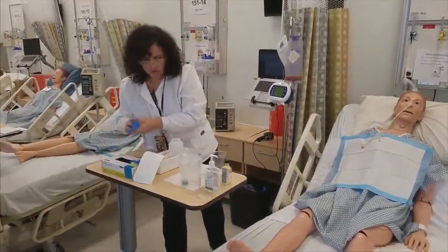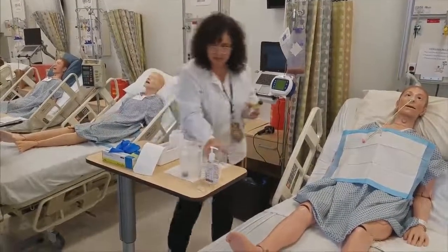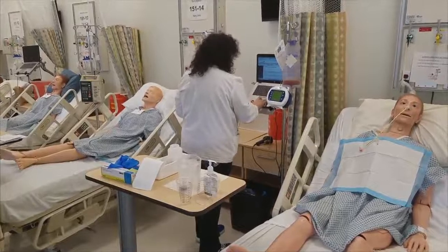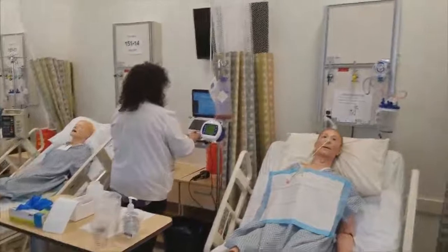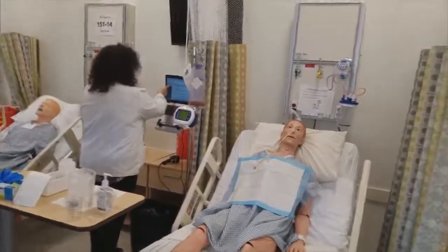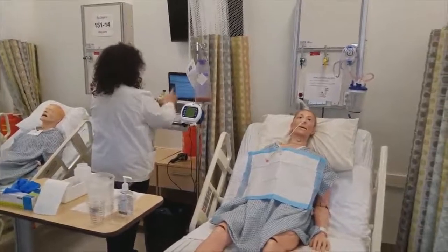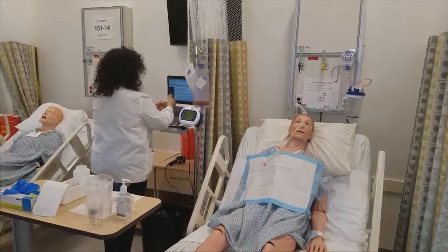Okay, so I have my medications that I have to give, so let's get back into medication administration mode. I'm going to pull up the EMAR, and I am going to do check number 2. So I'm checking these along the EMAR. I note the right patient, drug, dose, route, time, reason. And I would do that for both of them. Drug, dose, route, time, reason. So that is check number 2.